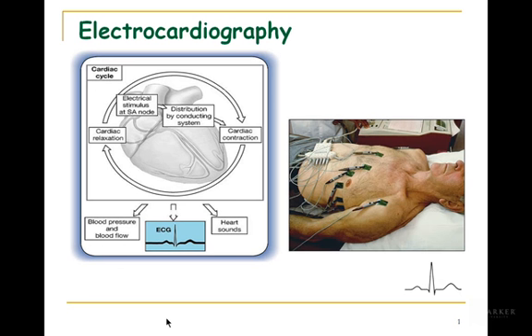What you're recording, or what you're going to be able to see, is it's going to indicate direction, it'll indicate magnitude of this electrical activity, and it's plotted against time. The ECGs do not record action potentials. What they record is total electrical activity that's generated by the heart.